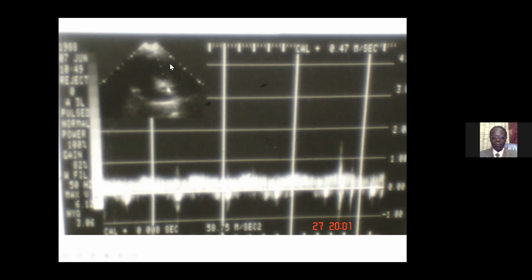So this was a liver transplant, and we were trying to find out if there are any signs of rejection. Of course, the transplant that we do commonly is a kidney, and we do the same even for the kidney. We look for potential rejection quite early using Duplex Doppler.